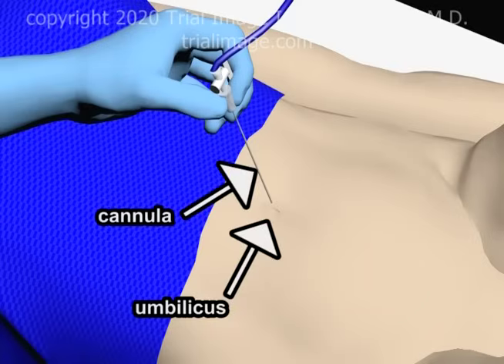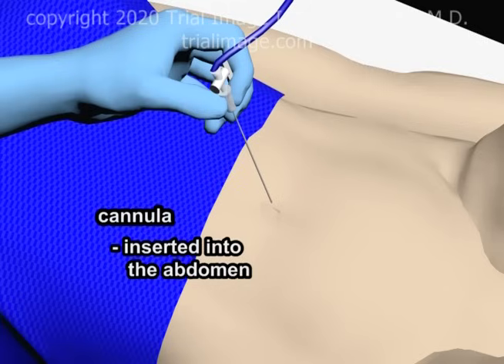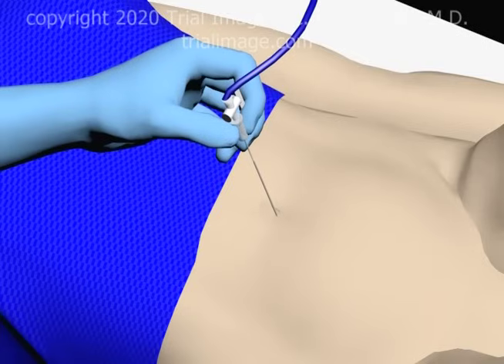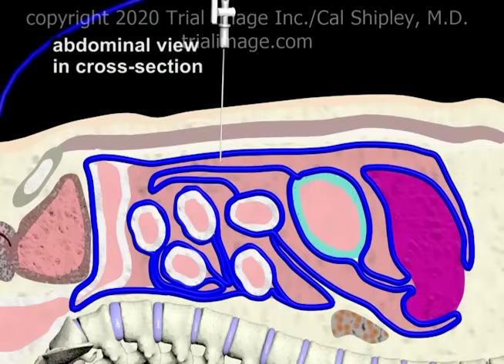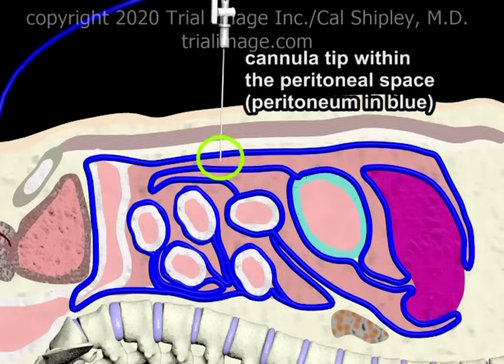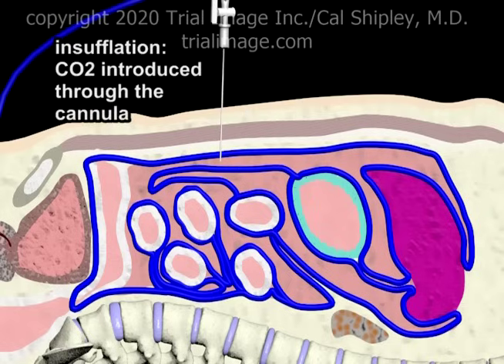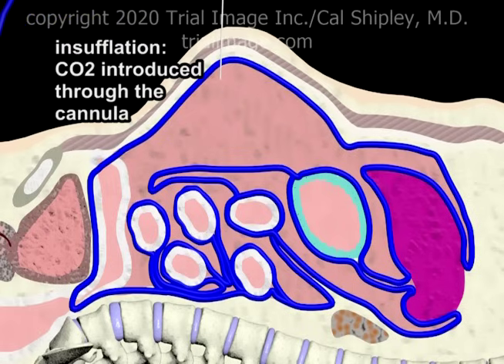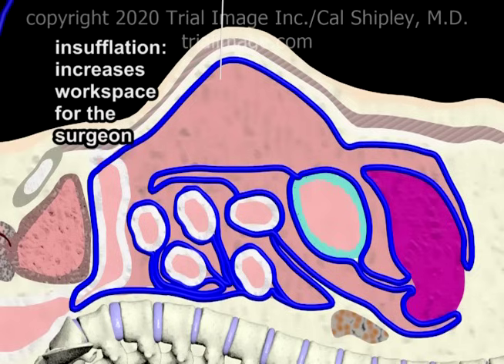The first step in the procedure is to insert a thin, needle-like cannula into the abdomen in the area of the umbilicus. Viewing the abdomen from the left side in a cross-sectional view, we can see the cannula inserted into the peritoneal space. In a process known as insufflation, carbon dioxide gas is passed through the cannula into the peritoneal space. Insufflation increases the workspace within the abdominal cavity for the surgeon to manipulate instruments during the procedure.